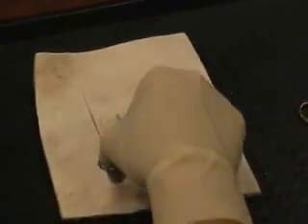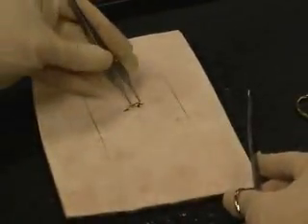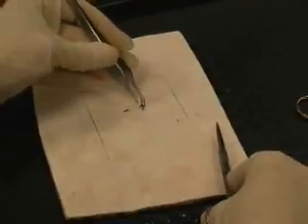At this point, I'd like to go ahead and show you some stapling technique. As we talked about in class, staples are utilized frequently. They heal very, very well. So just for a moment here, I'm going to get my staple gun.